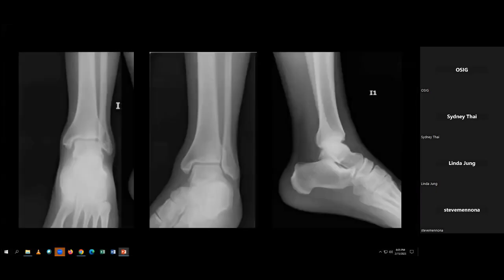Brings back memories. All right, so as Dr. Monona was saying earlier, orthopedic surgeons wear many hats. One of the first hats you wear is you're also a radiologist. So your intern year, you learn how to read x-rays. And the best way to do that is to look at a bunch of normal x-rays. So we'll start off by just looking at normal views of an ankle.